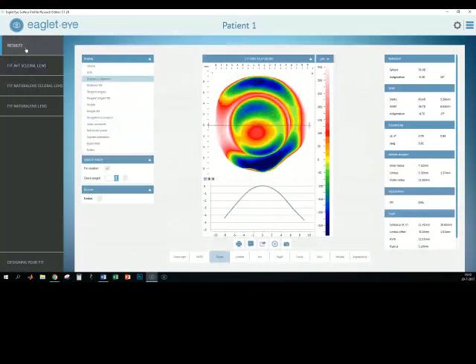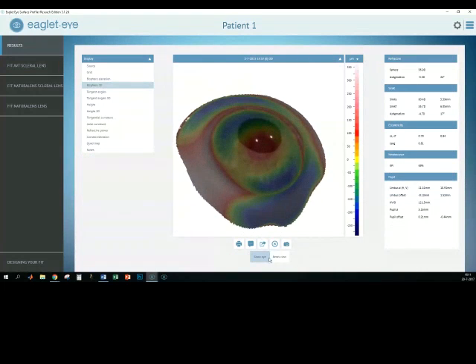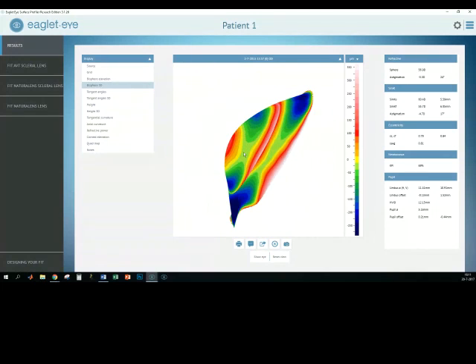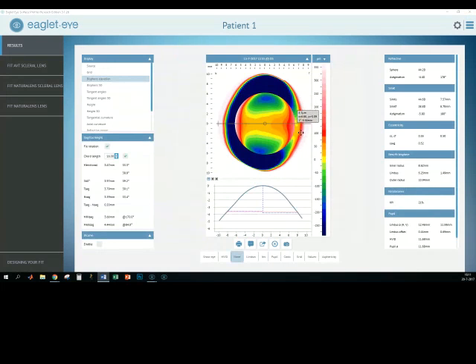Let's go back to the screen. I want to show you some more examples, because this is the screen you're looking at as an expert, but it might be very interesting to show your patient the 3D model, and you can show them exactly the cone location, where it is on the eye. Okay, let's go on to the second example. Let me put it up, one moment.